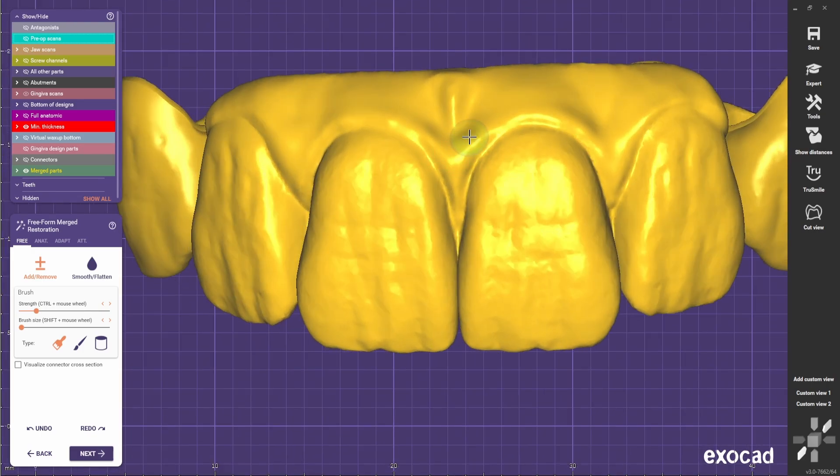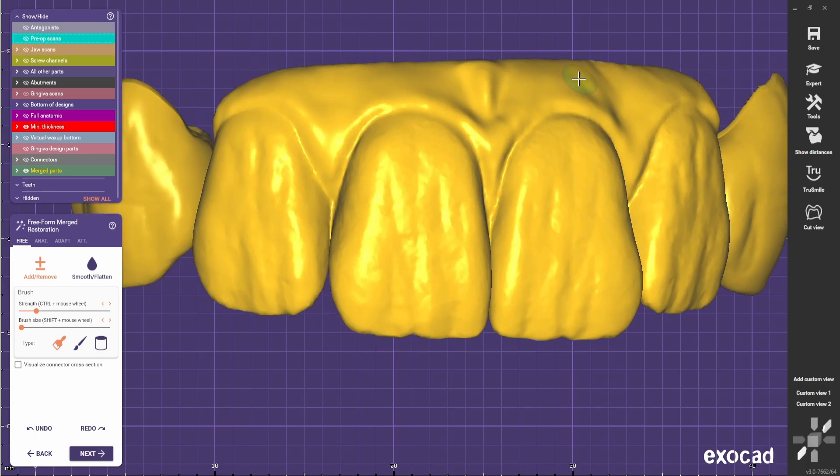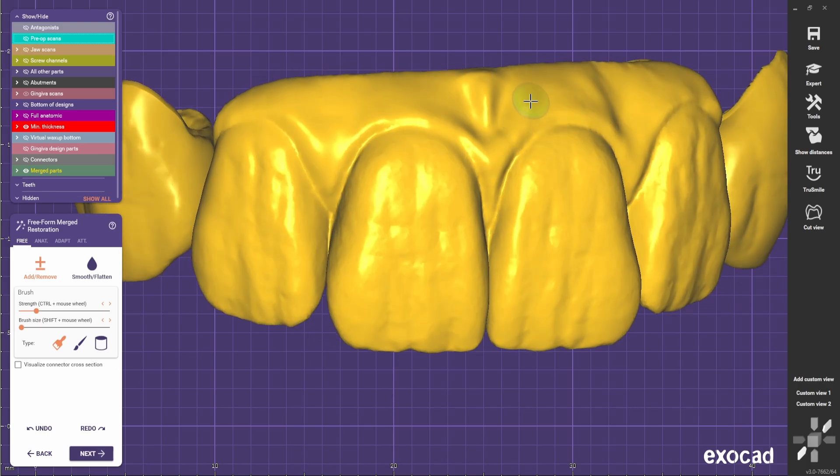For now we're going to leave it like this and we're going to do the roots, showing the root volume that usually we can't see.